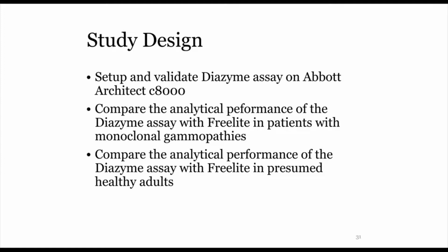Our study design was as follows. First, we set up and validated the Diazyme assay on one of our Abbott Architect C8000s that we currently use in the clinical chemistry lab. We then compared the analytical performance of the Diazyme assay with Freelite in a set of 61 MSK patients, as well as a separate set of 127 presumed healthy serum donors.